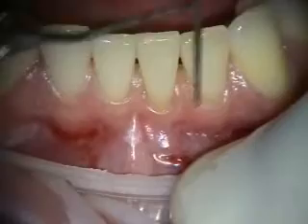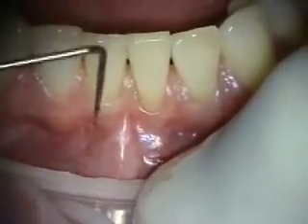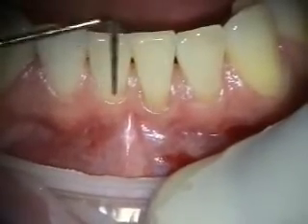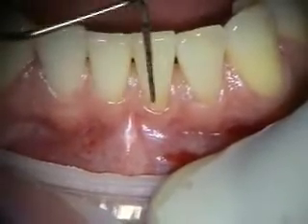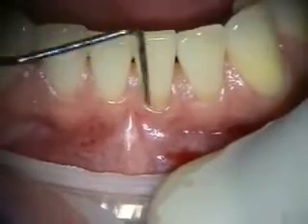Today we're going to be doing some alloderm grafting. Tooth 24 and 25 are really thin, so we're going to be loosening the tissue, placing some alloderm, and trying to coronally position to get a little coverage on 24.